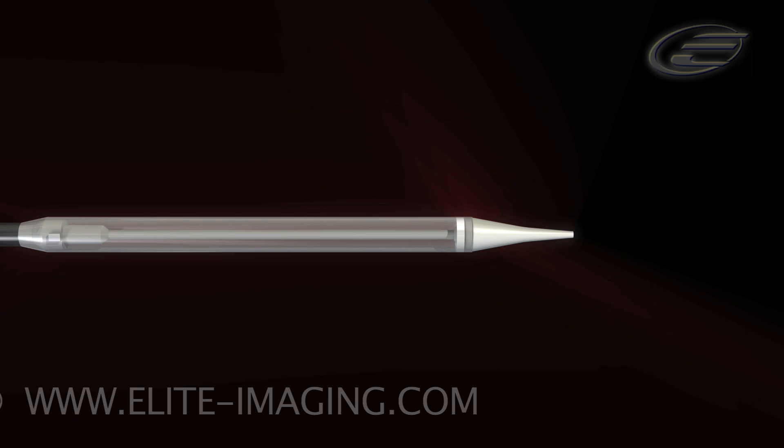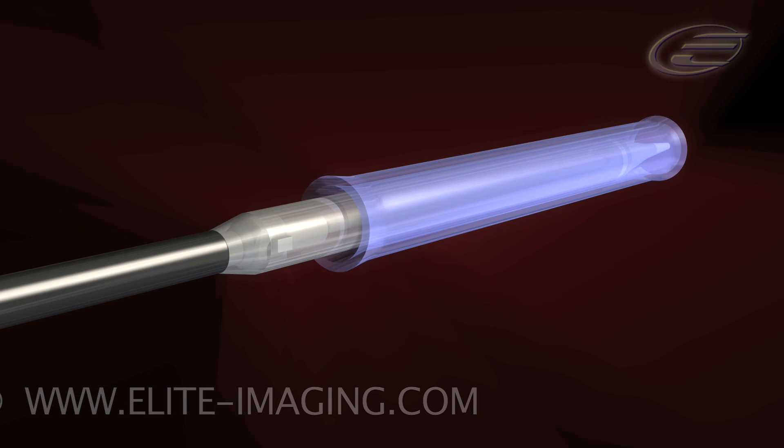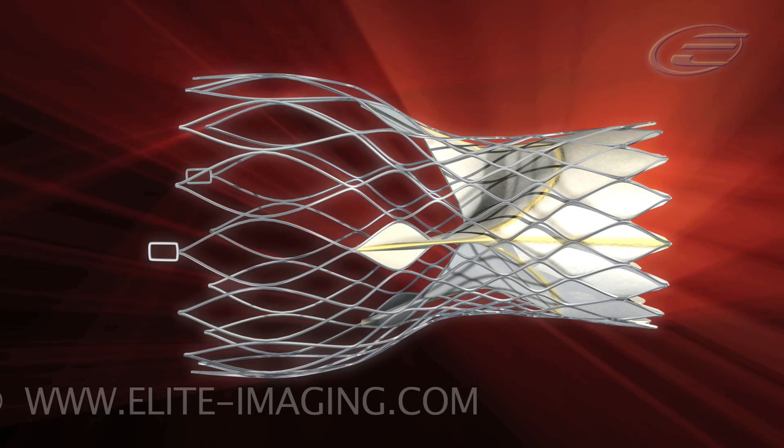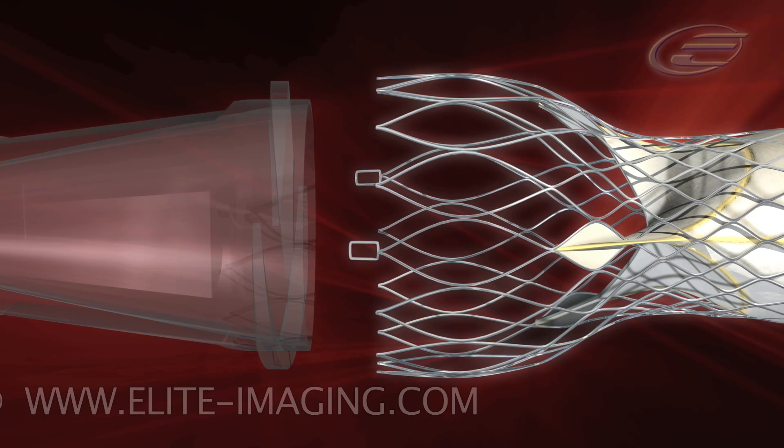Loading the valve. Advance the tapered outflow tube over the catheter. Gently squeeze the outflow part of the frame.